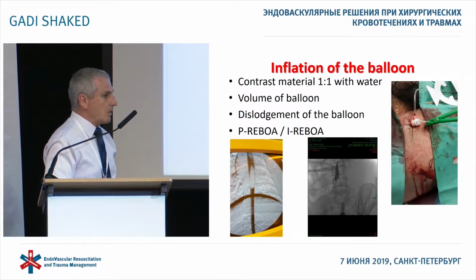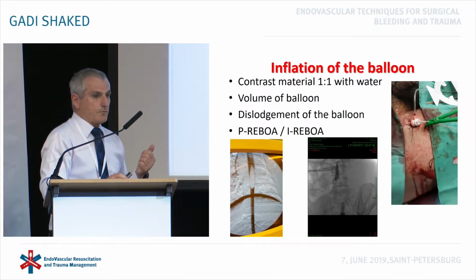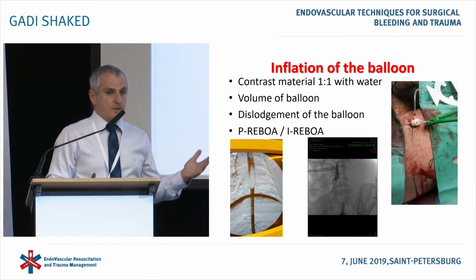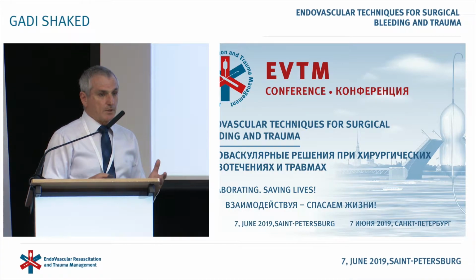Okay, so one more sentence about removal of the balloon. First of all, remember to deflate it very gradually to prevent ischemia reperfusion and an instant drop of blood pressure to 0 if you do it too rapidly.